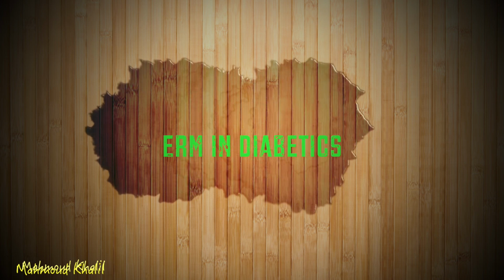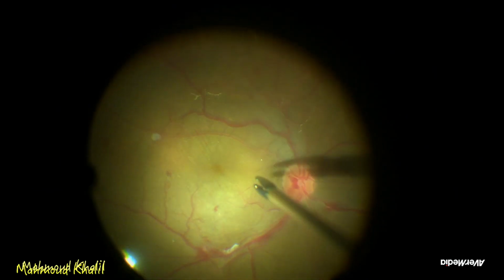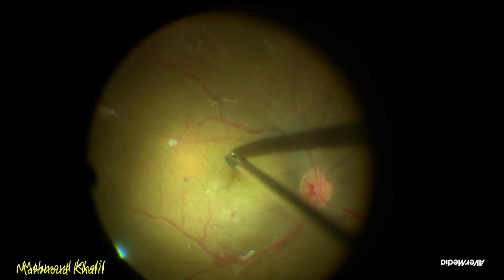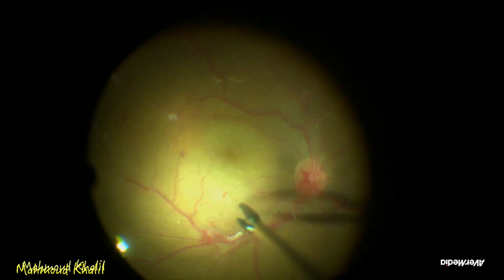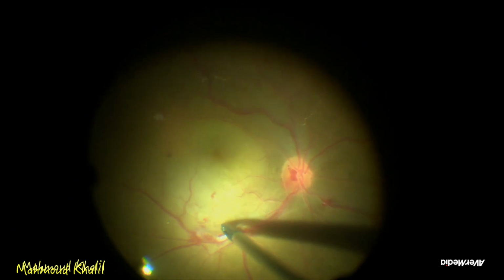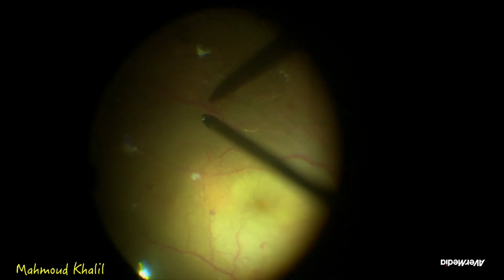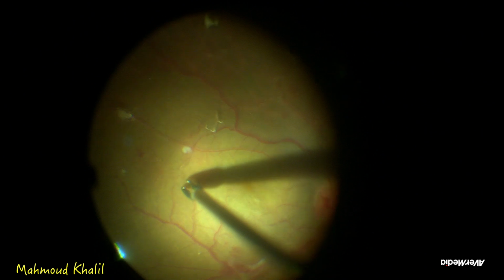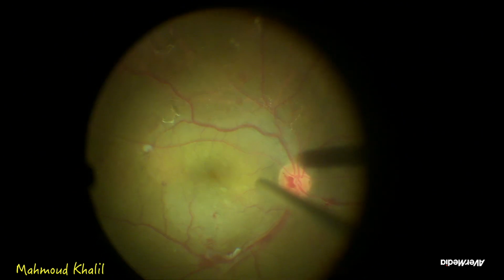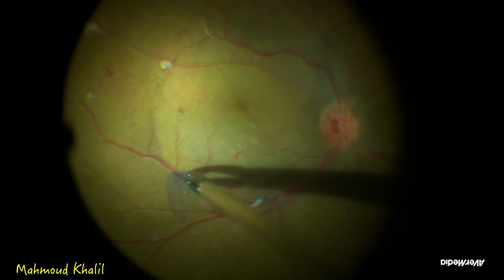The second video is an epiretinal membrane in a diabetic patient. As we see, the epiretinal membrane is well identified without staining, so starting to remove the epiretinal membrane without doing any stain, as long as we can see. At any moment, if we can't identify the epiretinal membrane, we can stain. After removal of the epiretinal membrane, then we will stain with BBG to identify if the ILM is removed or not. In this case, after staining the ILM is removed coincidentally with the epiretinal membrane.